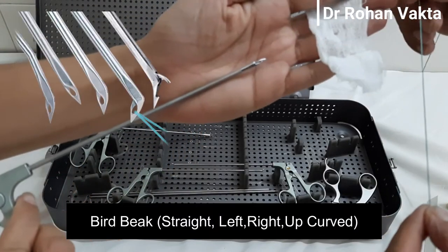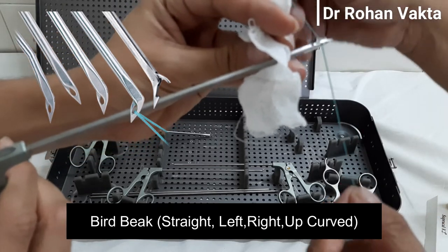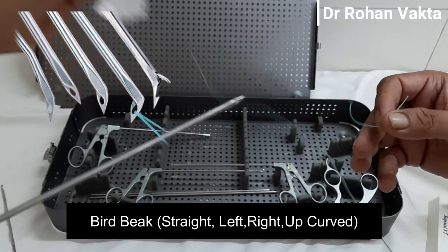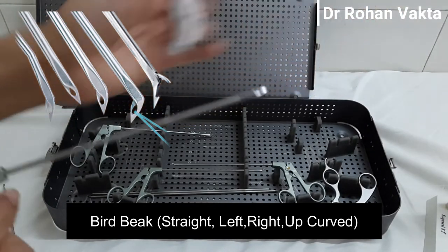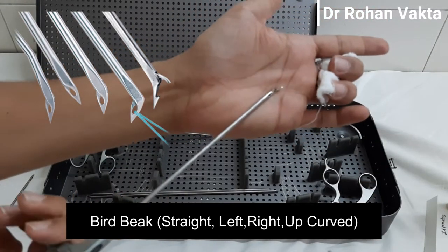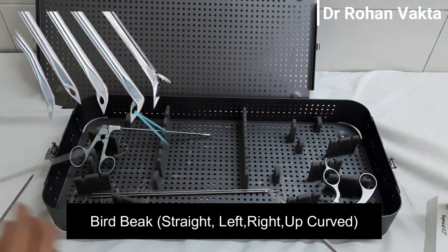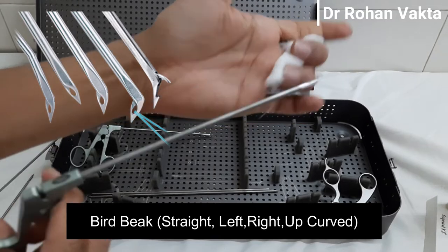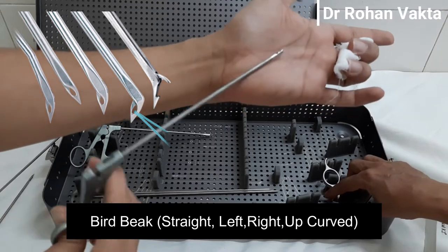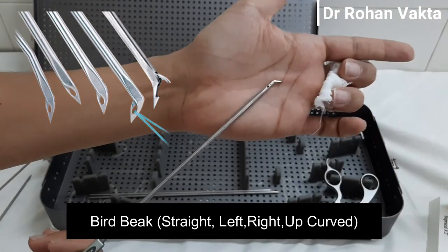This device is known as the bird beak. It has a sharp tip and is used to pass the suture material through soft tissue. This is the straight bird beak. There are other bird beaks of different angles — this is the upward-curved shape, this is the left-side curved bird beak, and this is the right-curved bird beak.